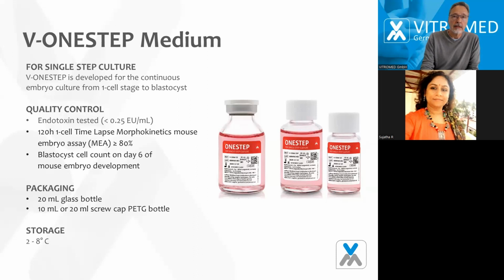The standard assay takes 96 hours, and it's just the result: how is the blastocyst forming rate of the mouse embryos? But here in this test, it looks also like a time-lapse system that you use in your lab on the way of the development of the embryos. When are the first, second, third divisions, at which time point during the development? And this gives you, of course, much more information, whether the medium is good for the embryos or not.